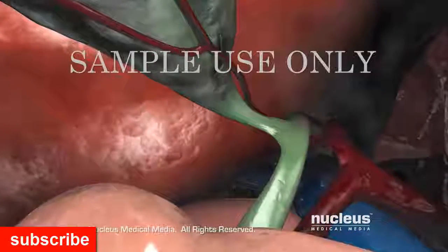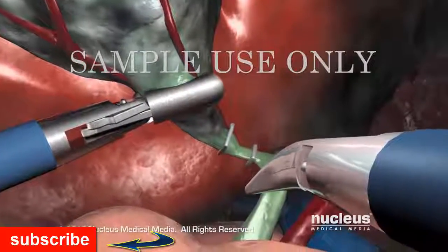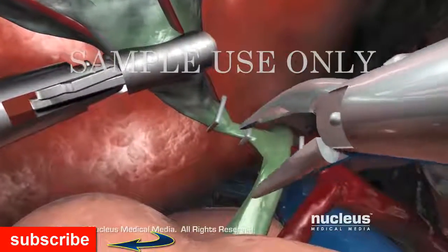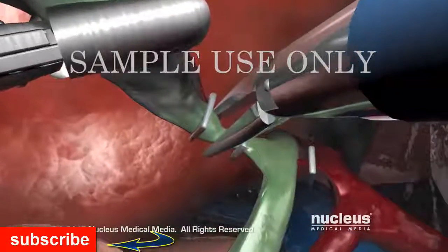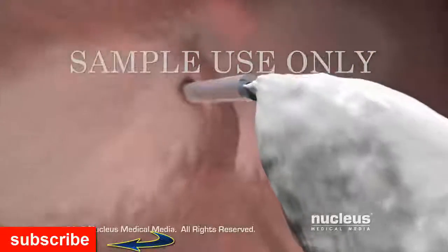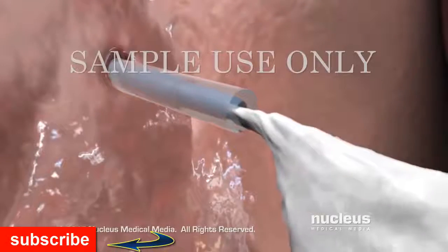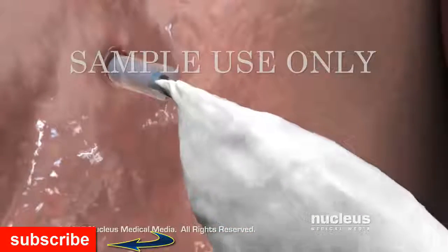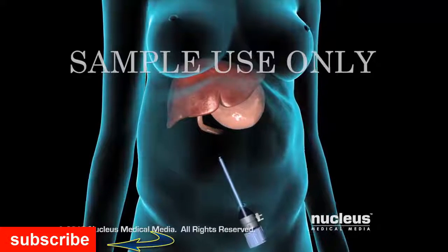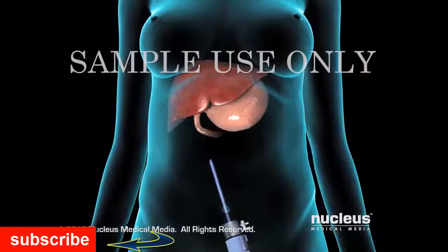Using instruments passed through other ports, your surgeon will grasp the gallbladder, clip off its main artery and duct, drop it into a specimen bag, and remove it through one of the ports. After the laparoscope is removed, a port valve will be left in place briefly to allow all of the carbon dioxide to escape from the abdomen.